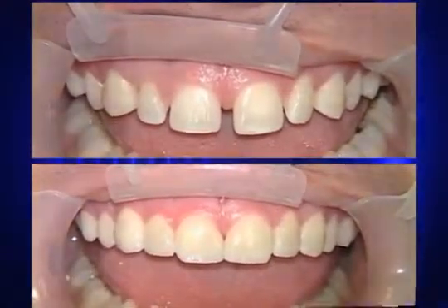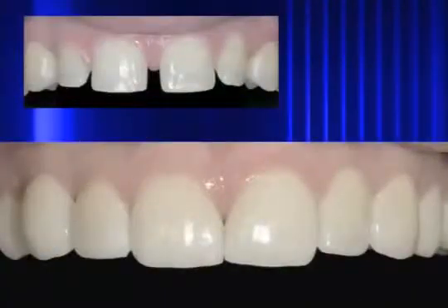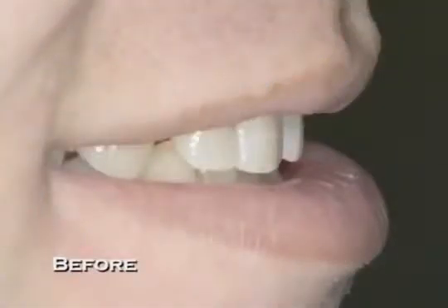This case illustrates one of the really good uses for no-prep veneers. The patient came in with multiple diastema between his teeth, and he could use a little extra tooth length as well. And since there wasn't a big requirement to remove any tooth structure, this case really did lend itself towards a no-prep approach. Another one of the things that makes this a great no-prep case is the fact that we don't have many facial limiting factors.